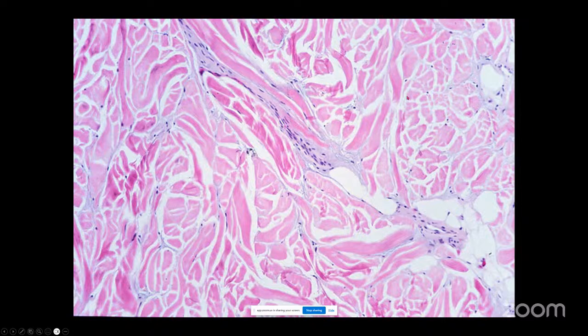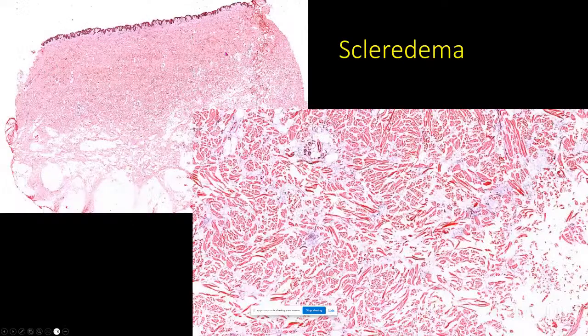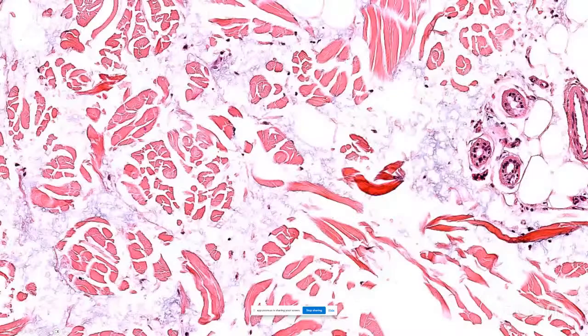So I imagine if you took a biopsy of an older lesion, you wouldn't have as much high hyaluronic acid identified in the dermis. So here, staining with colloidal iron. I like this because you got sort of the regular pink of the collagen, and you got the blue sort of streaking through. It looks really pretty, I think. Here's just another example. People talk about fenestrated collagen. You see here, this is also from our teaching set. You can see splaying of the collagen a little bit by this grainy, bubbly mucin on H&E.